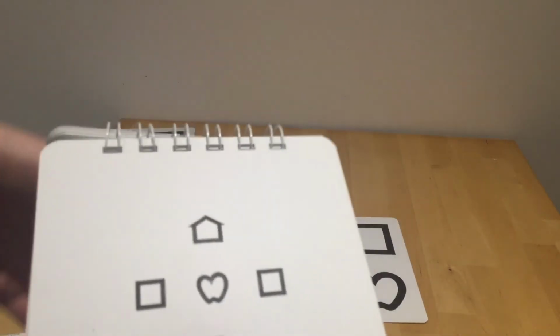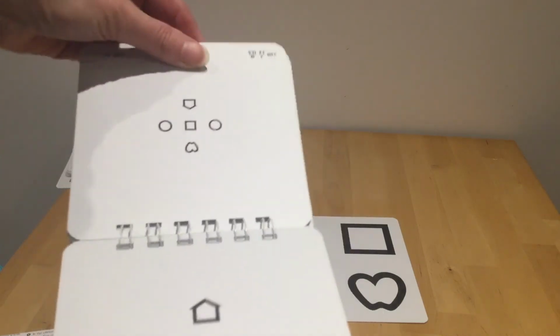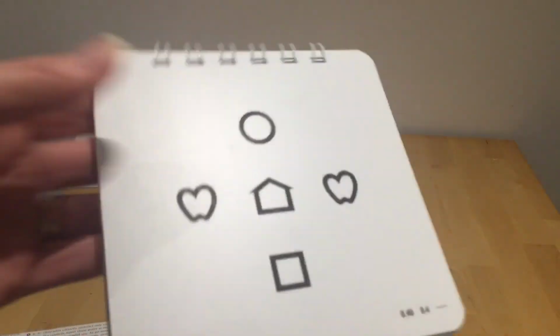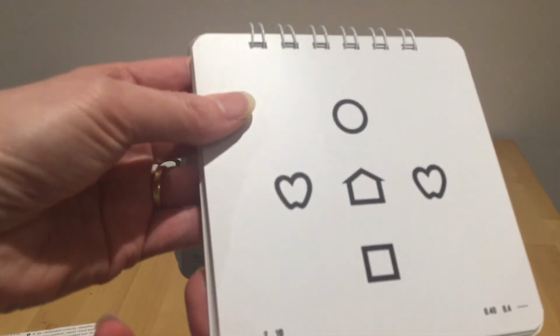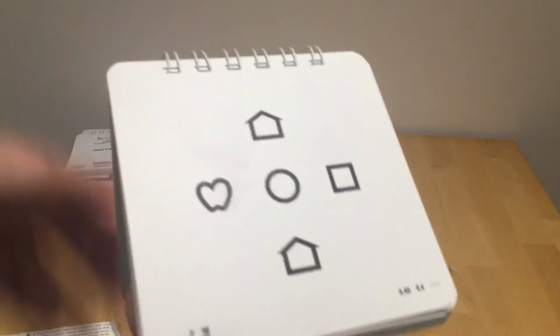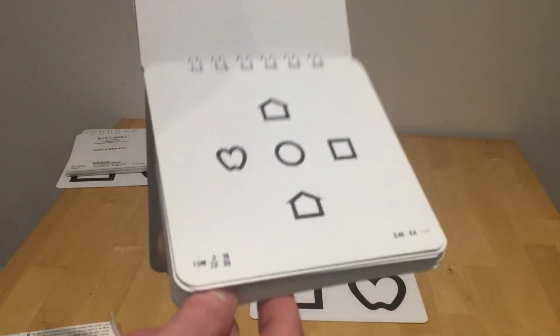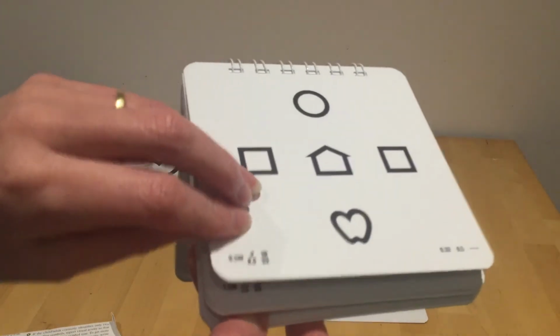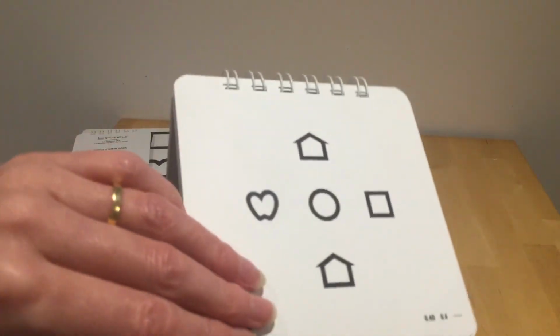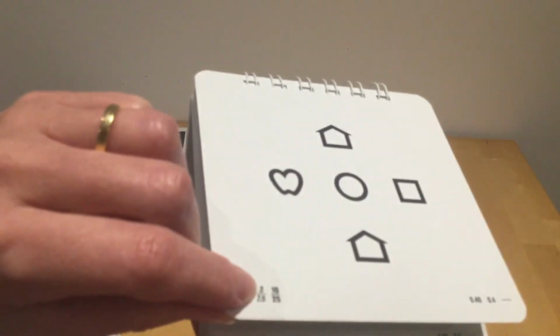So then what you would do is you would go back to your 7.5, because that's the previous size, and you'd go to the very first one in that size. That's still 7.5. That's 9.5. So go back to this one. Remind me, what was the first one there? That's the heart or the apple.